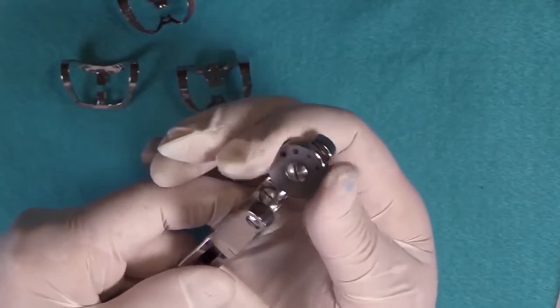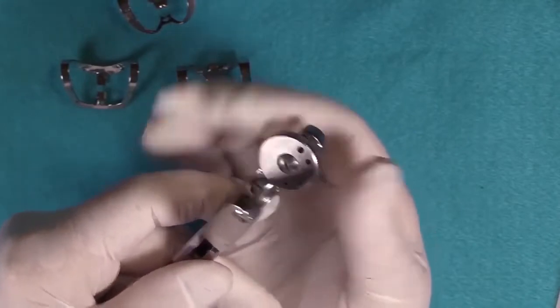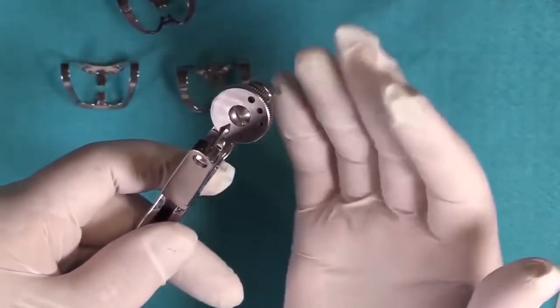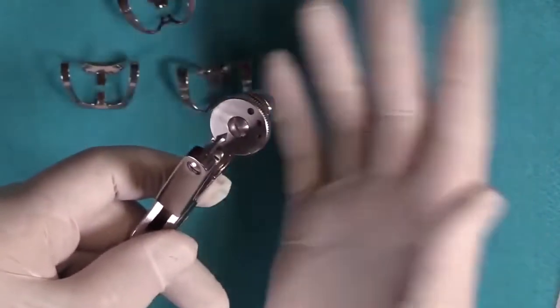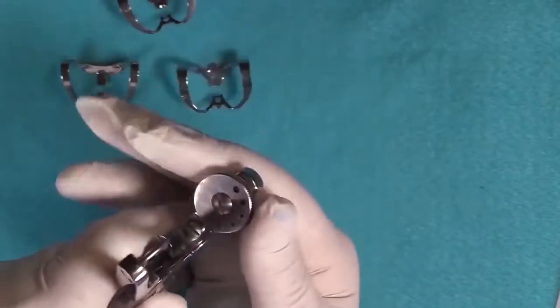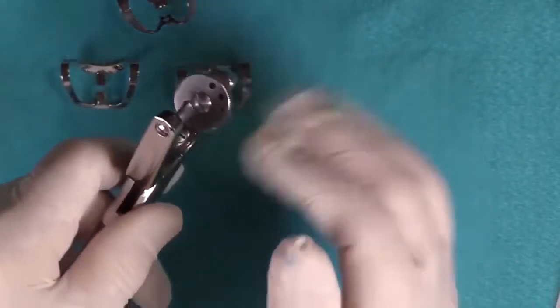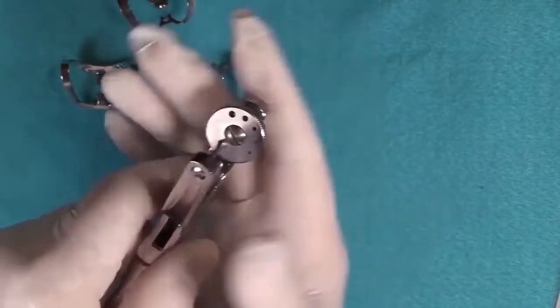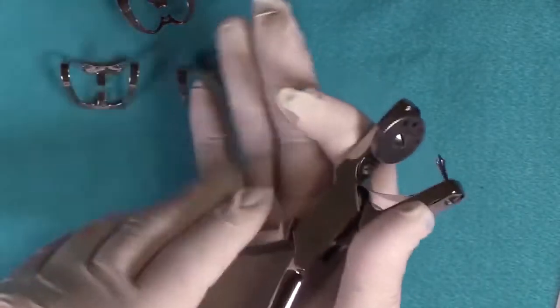Now, if you're using another style punch, an Ivory style punch, for example, that has 6 holes. I never use the 6th hole on that one because it's way too big. If your hole size is too large, you're going to have leakage around the necks of the teeth. And then you can't invert properly either because the dam won't turn under. We'll talk about that procedure in a little bit.